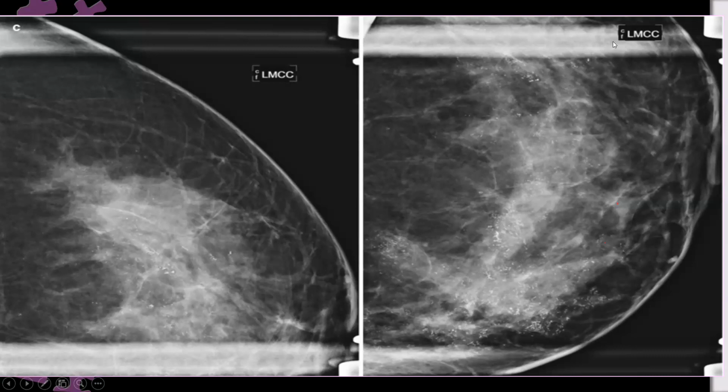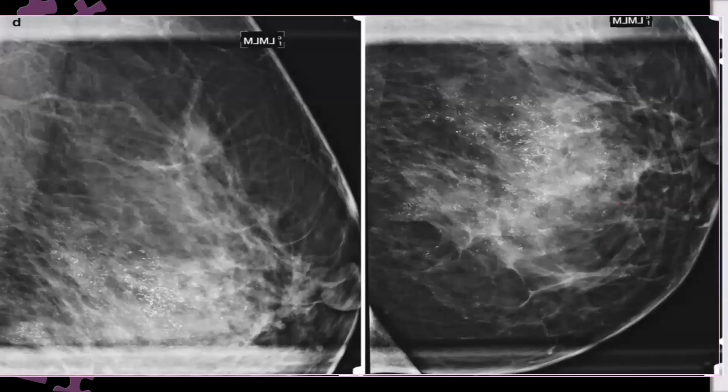And look here, lateral to the nipple, and they complete it here. This is the lateral portion. So this portion of the breast from medial and lateral quadrants are involved. But let us see where exactly these, the medial and lateral, in the upper or in the lower or both. We have to go for the MLO.